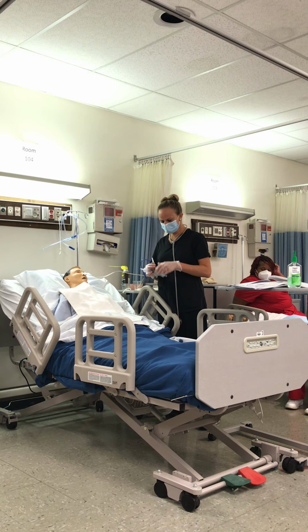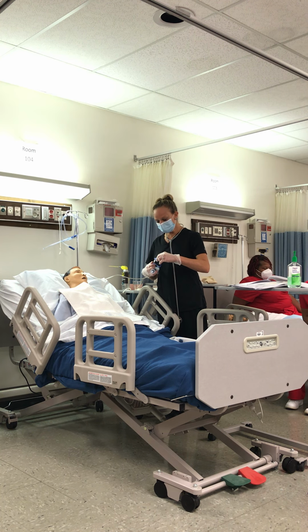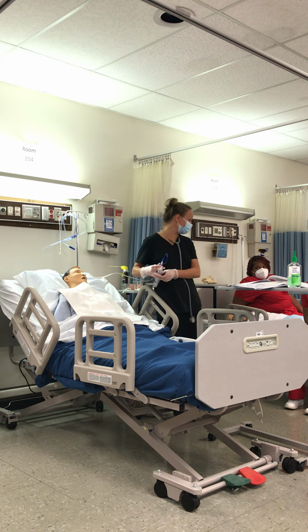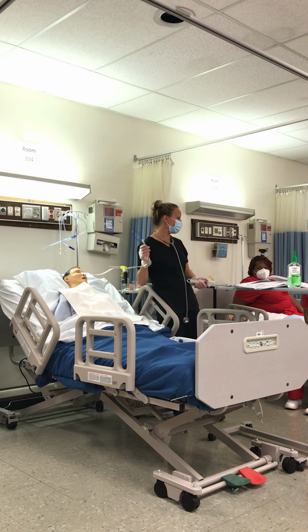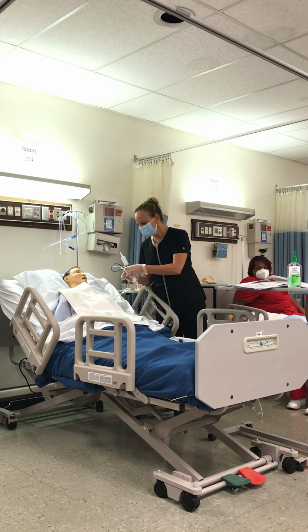This, I never understood why it's there. It's there. This is your, there it is. That's why it's there. I told you I never used one. So this is your cap, right? I told you I never used one of these. This is your cap, okay? So when I instilled this, or when I inserted this rather, I would want to go ahead and cap that, okay? Because what could happen? I was talking to one of the nurses here today, and they said that they were putting one of these in one time, and bowel came up. That means they had an ileus or something, big obstruction. So that's why I say you kind of want to have somebody with you, because it could be quite a mess.